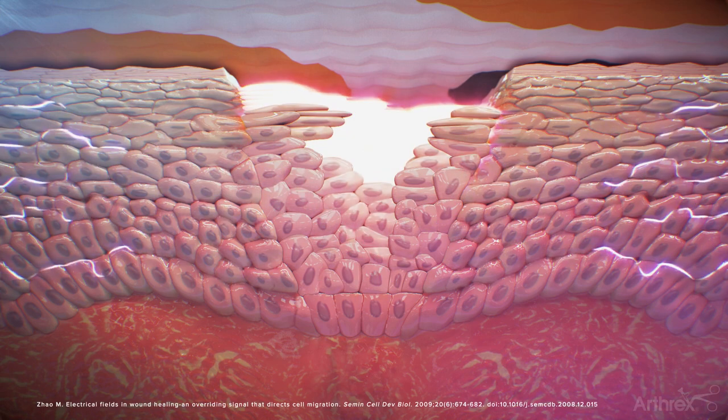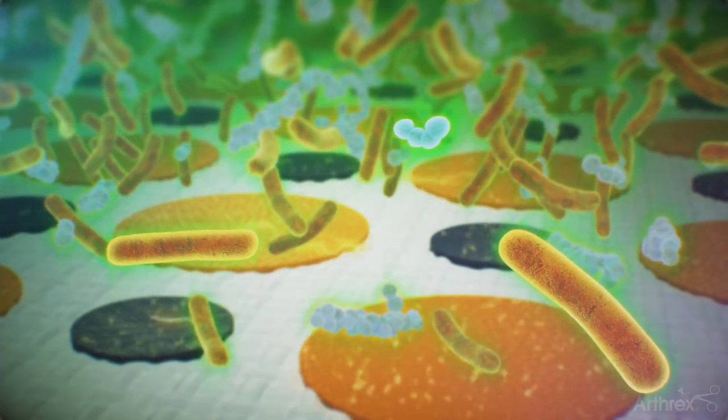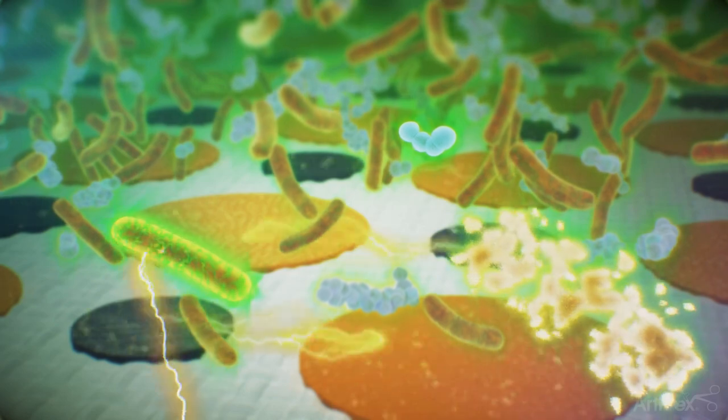Applied to the surgical site either before and/or after surgery to help reduce the risk of infection, Jumpstart has been proven to kill a broad spectrum of microbes, including microbes that have been shown to be resistant to antibiotics.